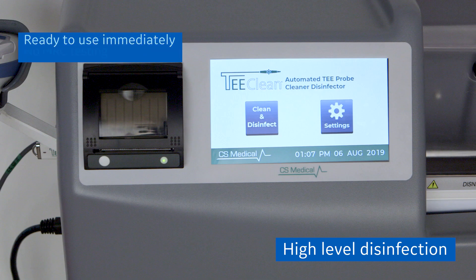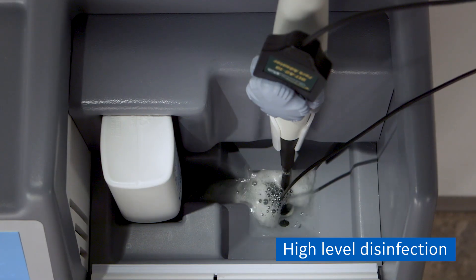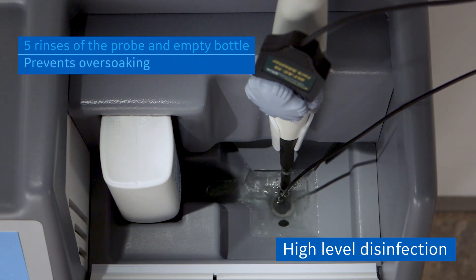No MRC testing is required. Once the disinfection cycle is complete, the T-Clean performs five rinses of the probe and the empty bottle of disinfectant. The system will automatically purge the disinfectant to prevent over-soaking.